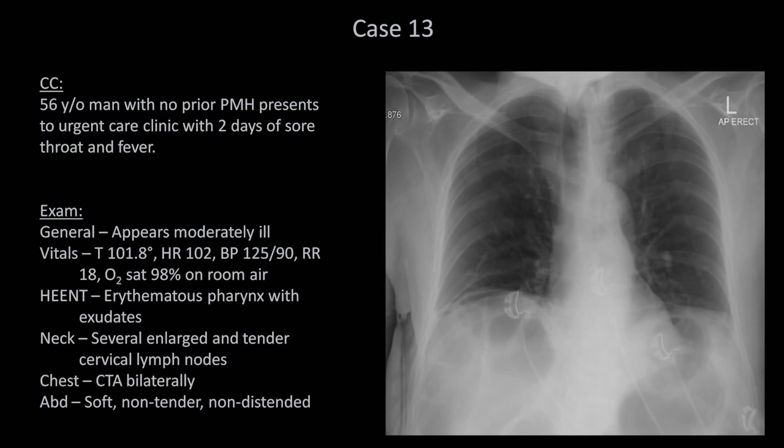Case 13. A 56-year-old man with no prior past medical history presents to urgent care clinic with 2 days of sore throat and fever.